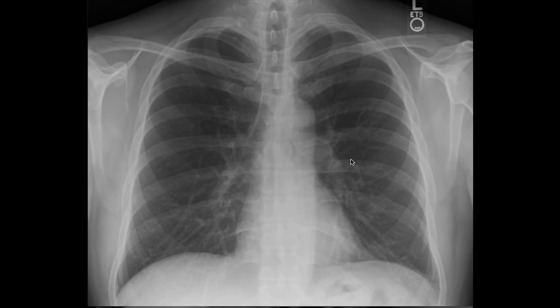One additional thing that is very interesting also, in the acute abdominal series, or acute abdomen, when patients come to the emergency and are suspected to have a bowel obstruction, which is a severe urgent case also, emergency case also, we do a chest X-ray. And why is that?